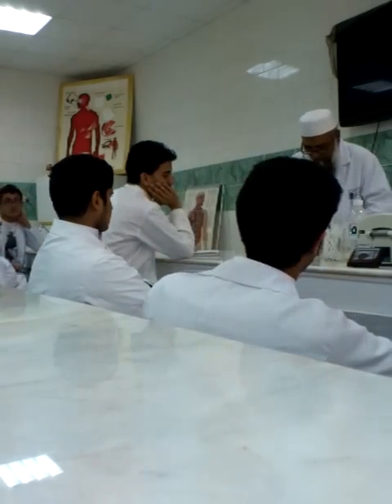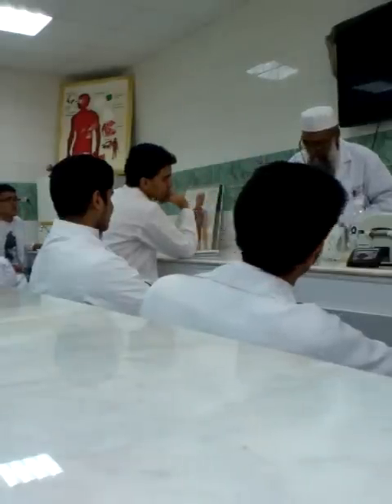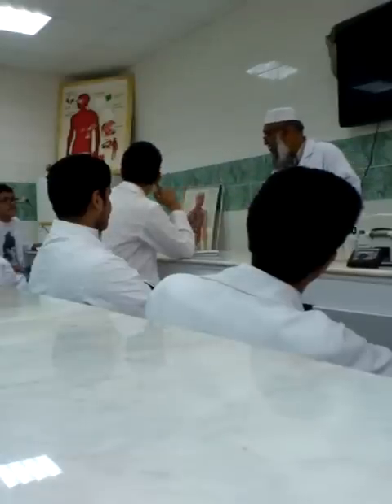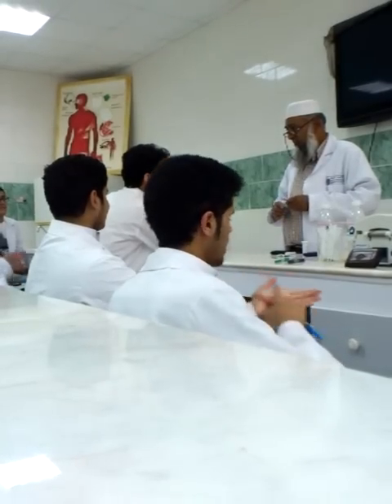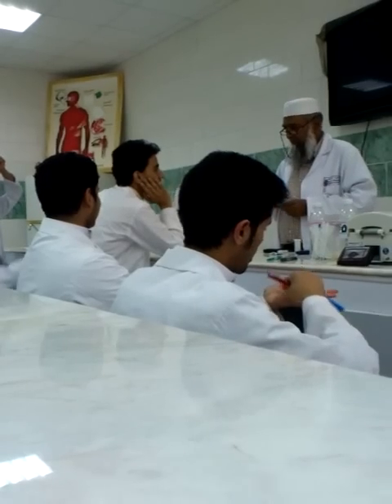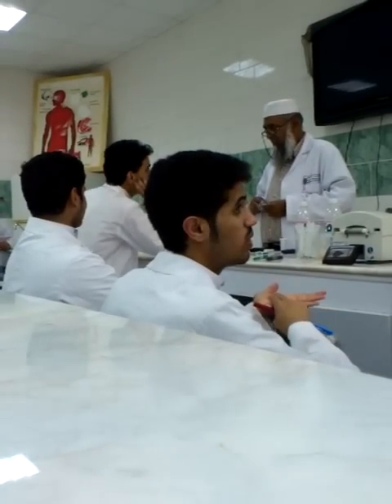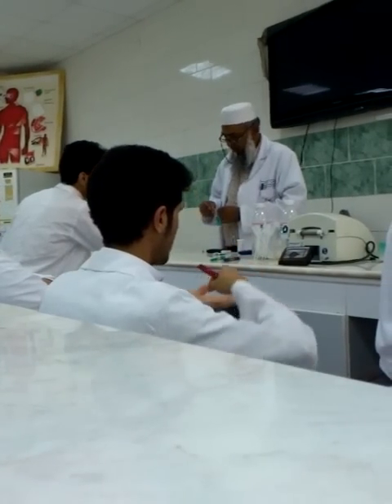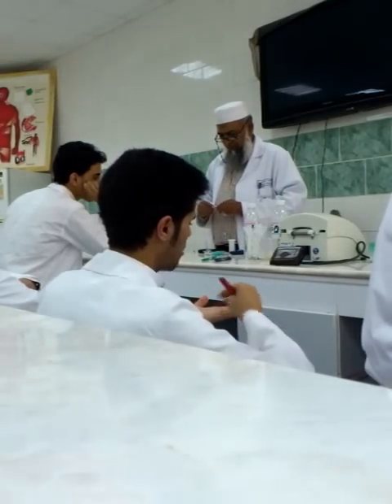Okay. Now who will be the volunteer today? Not only for checking his... so let's see.